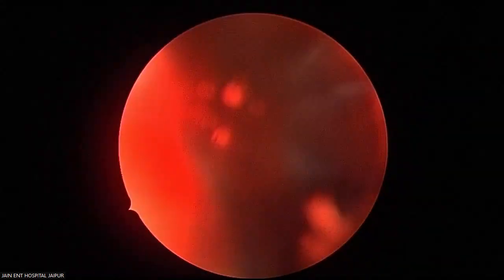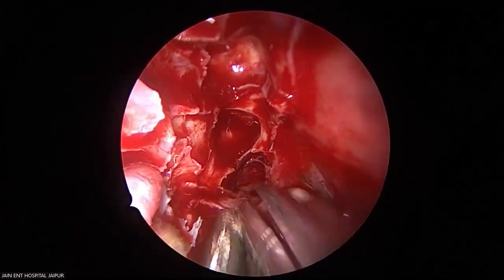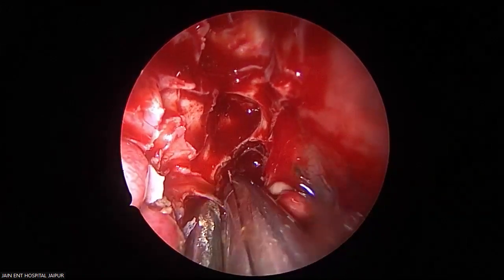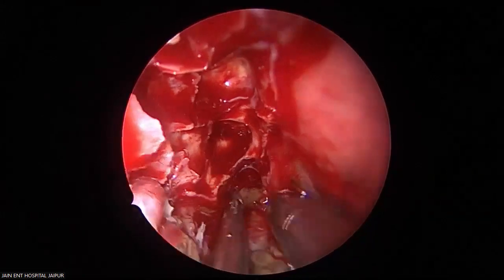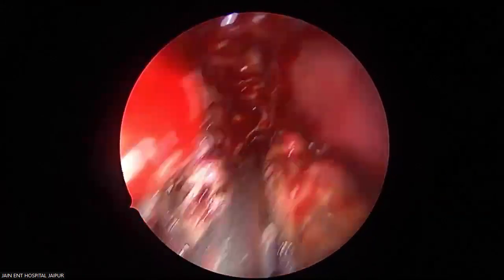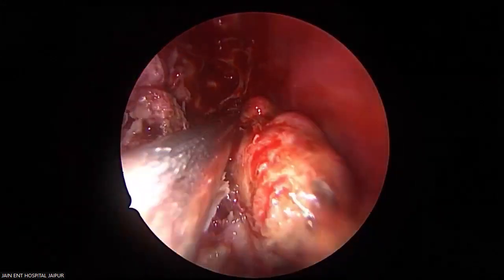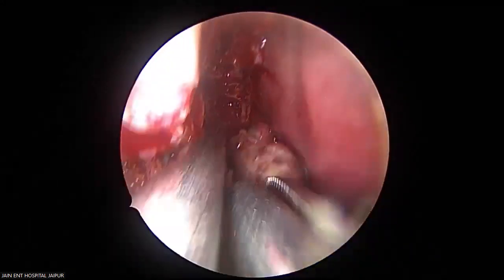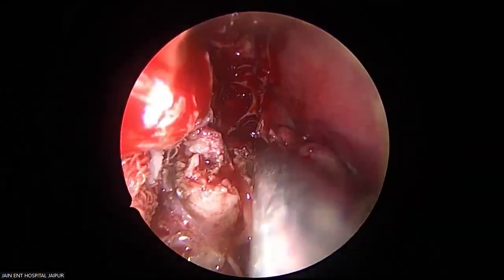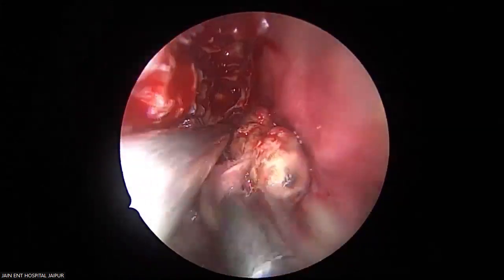See the complete superior surface of the tumor. See the medial and lateral tumor in continuity here.